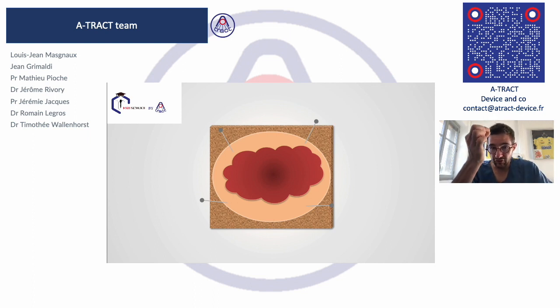Letting the small tip of the appendix with its mucosa. And after, we try to put clips all around the orifice, but never closing the appendix area in order to avoid appendicitis like it was described, for example, with macro clip.